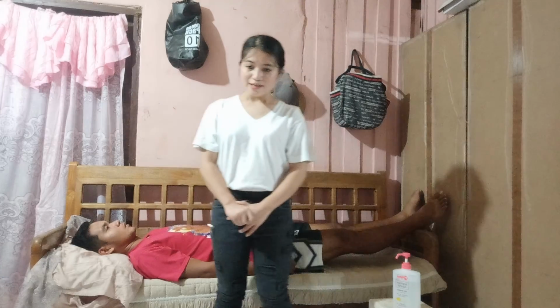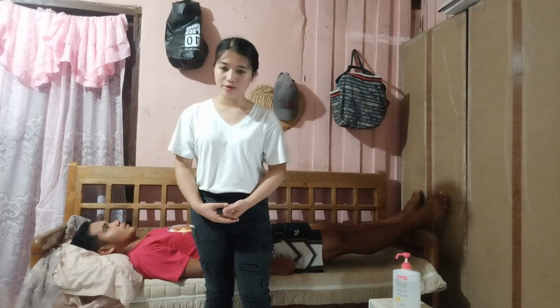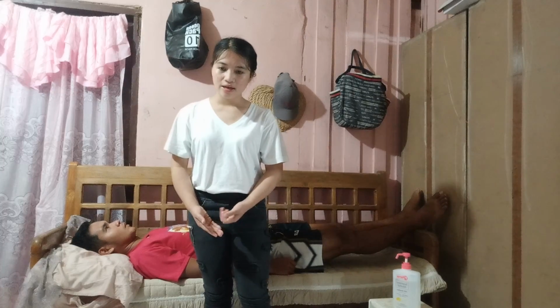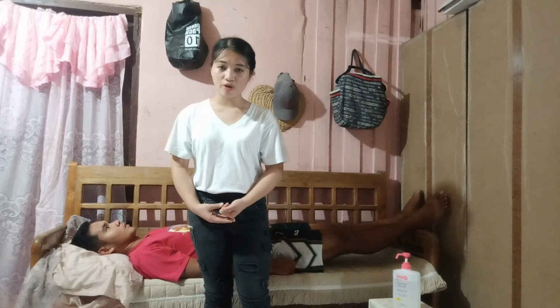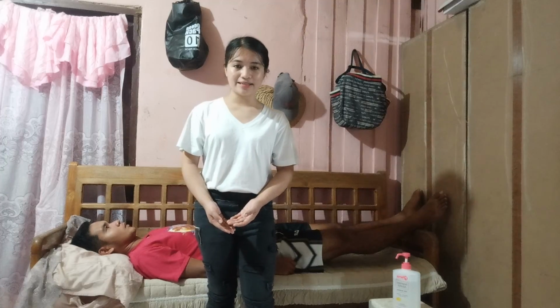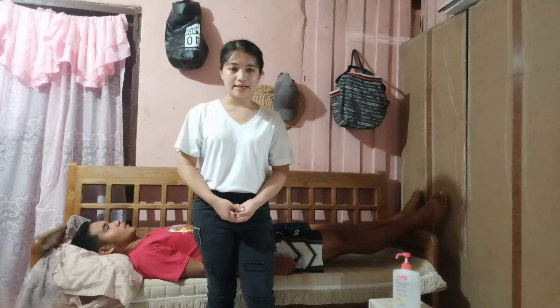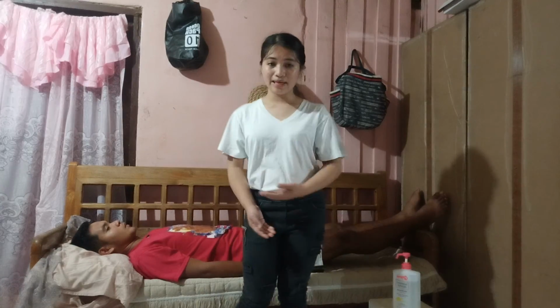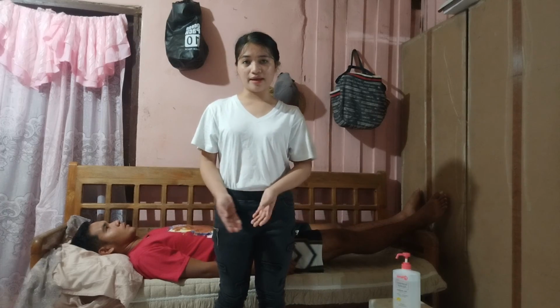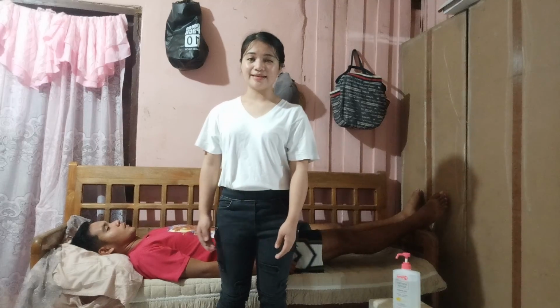So now let's proceed. The next step that we have to do is place the client's arms across the chest. So ask the client to flex the neck during the move and keep the head off the bed surface. So next, use the friction reducing device and assist to move client up in bed. Ask the client to push on the count of 3. So since our client needs only minimal assistance, we can skip those parts that I have mentioned because our client doesn't really need that maximal or greater assistance.